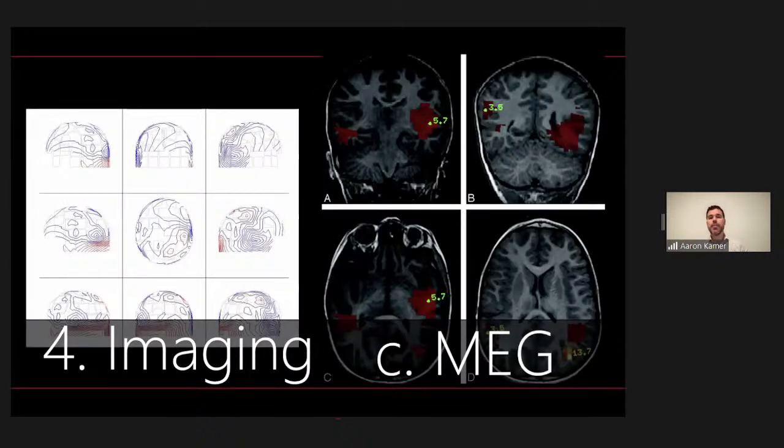All right, so MEG is something that's done at a lot of imaging centers, and it's basically a way to use magnetic fields in order to try to perform something akin to an EEG, but with deeper brain components, trying to get a little bit more of a three-dimensional look at where abnormal electrical activity is happening in the brain. One of the disadvantages of EEG is that we're only looking at the surface, and we're trying to extrapolate where deeply in the brain the abnormalities might occur, whereas MEG gives us a little bit more of an explicit look at what's happening deeper in the brain.